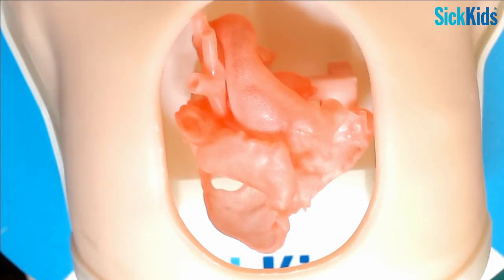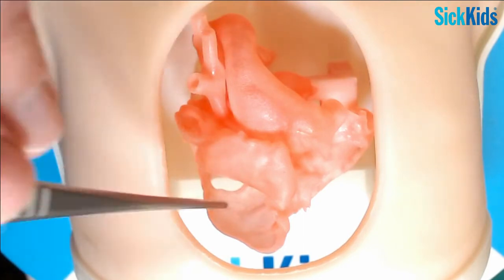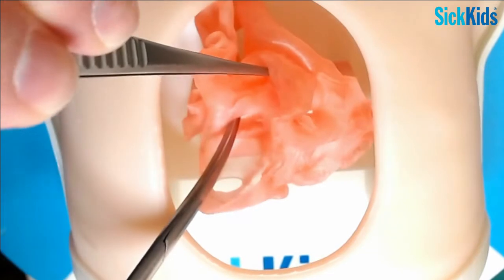So I'm going to show you the interdigitating technique. I'm not going to sew everything. I'll do some interrupteds, and because it's a lot of sewing, it takes a long time to sew all this. But you'll get the sequencing down in terms of what we do. So here you can look at the first thing in the ASD.